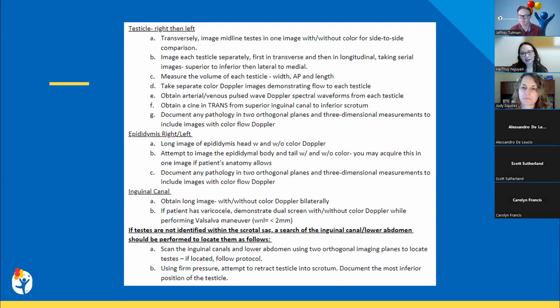I don't think we have a specific protocol, like you stated, where we image the side of pain first, but our first image is always the one you presented, the transverse of the two testicles, put together with the blood flow. With that, if there is absent flow, they will immediately go straight to that and then call us. I think they're aware enough of what the absolute finding is for testicular torsion. I don't want to give too much of your talk away, but whatever is needed to know for testicular torsion, they're acute to that.